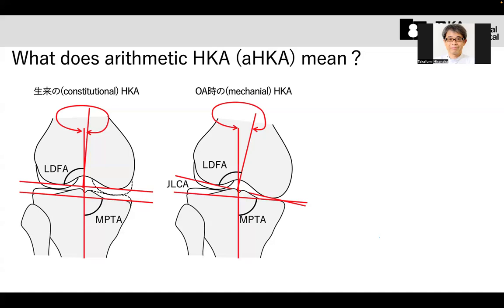We can estimate the patient's native HKA, hip, knee, ankle. Okay?